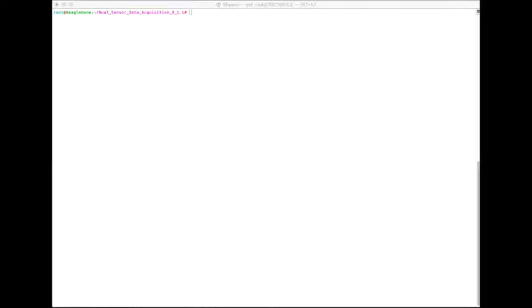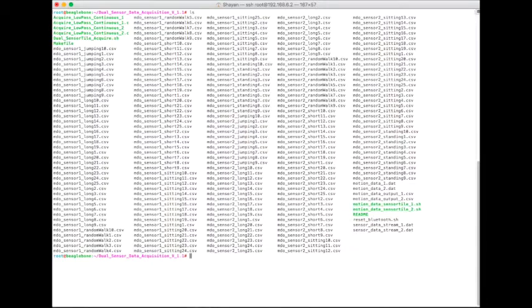In this section, I want to demonstrate the files that were gathered via the dual sensor data acquisition version 1.1. The final data that we used were 15 trials for each of the three motion types. That means 15 trials of data for short strides, 15 trials for long strides, and 15 trials of data acquisition for sitting. And that includes sets of data for each of sensor 1 and sensor 2. As an example, I will open up the files and demonstrate a couple of them.